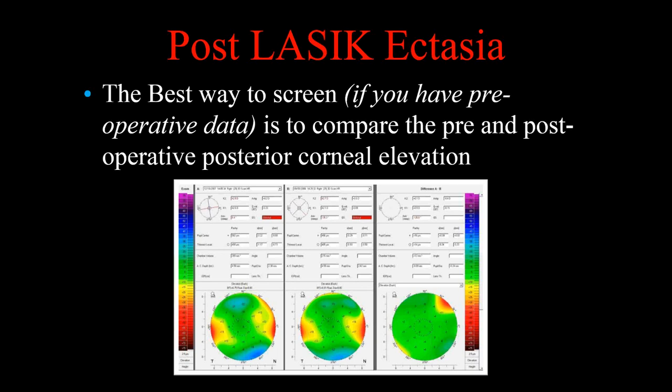Okay. I have actually just one last question here. Do you have a similar age-related guideline for the final D regarding PRK? I would love to say yes, but I have to be honest with you, and that is I actually really like PRK. Unfortunately, my optometrist and my referring base doesn't. So the volume of PRK that we do, which I wish was higher, is not high enough for me to really come up with those numbers. In addition, we tend to do PRK on patients that we feel are contraindicated for LASIK. So it's a skewed population.